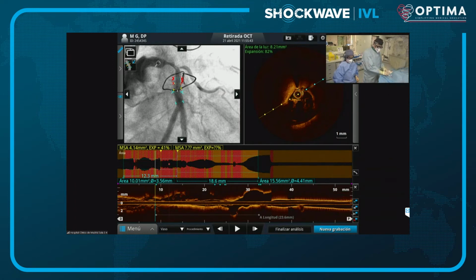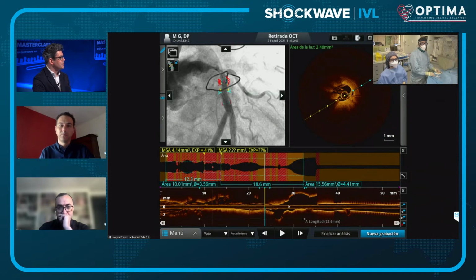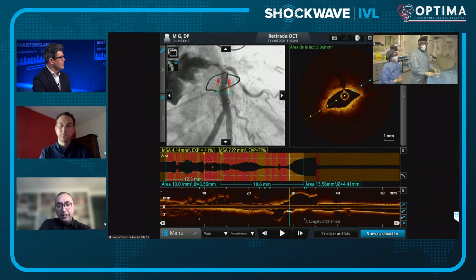So Azeem, could I ask you to comment, what's your interpretation of these OCT findings? What device would you select, in particular what Shockwave balloon size would you use? And what's your interpretation of the calcium distribution here? Yeah, great question. I'm going to bounce that back to both you and Javier in a second, because I'm yet to learn from both of you too.